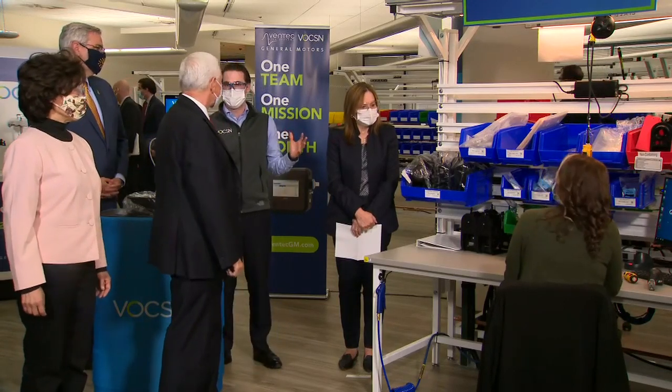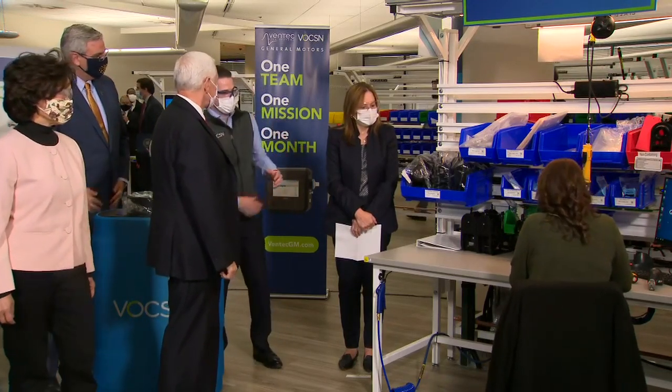So in this case, everything's designed on the center band. You pop off the front and the back case, and you have access to every single subassembly. So she's starting this process now.